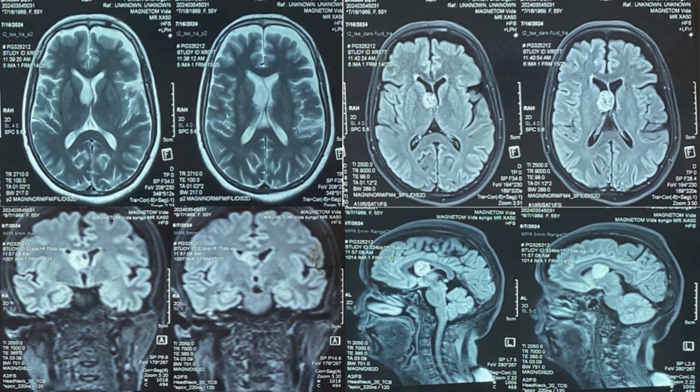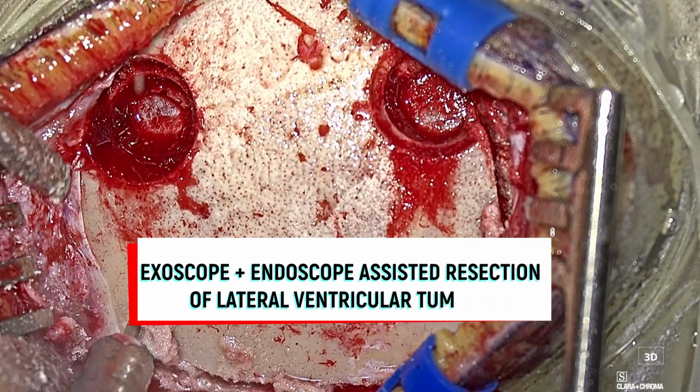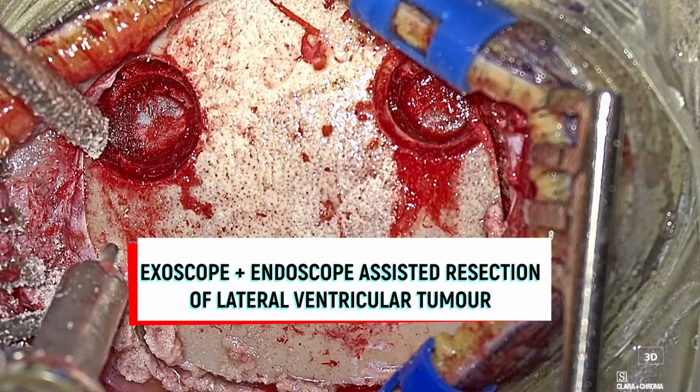Her radiology suggested a T1 hypo, a T2 FLAIR hyperintense lesion with no diffusion restriction or susceptibility changes. Her contrast imaging showed a non-contrast enhancing lesion in the right lateral ventricle abutting the septum pellucidum at the level of the foramen of Monro. She was planned for an exoscope plus endoscope assisted resection.